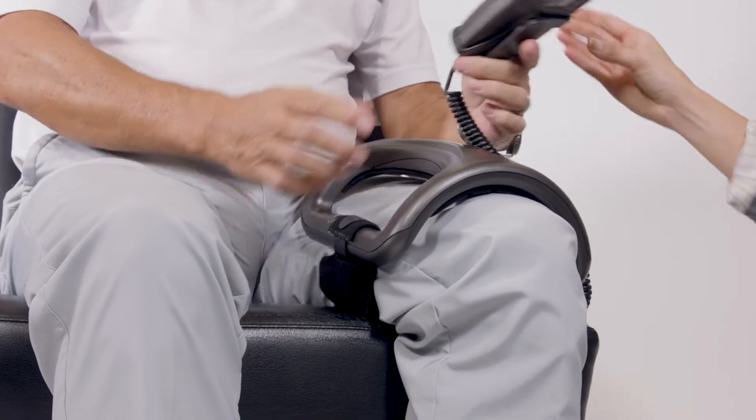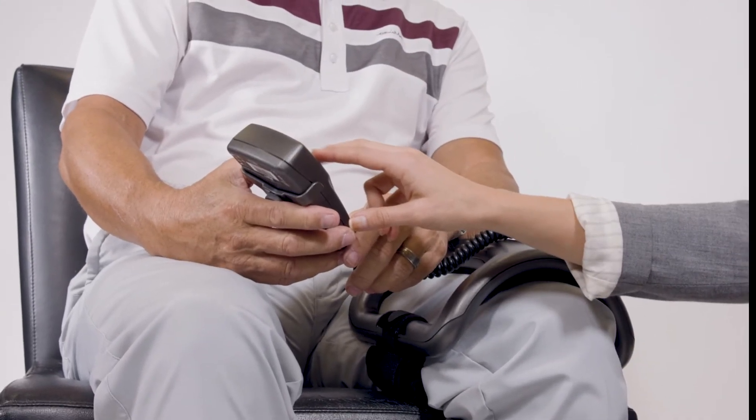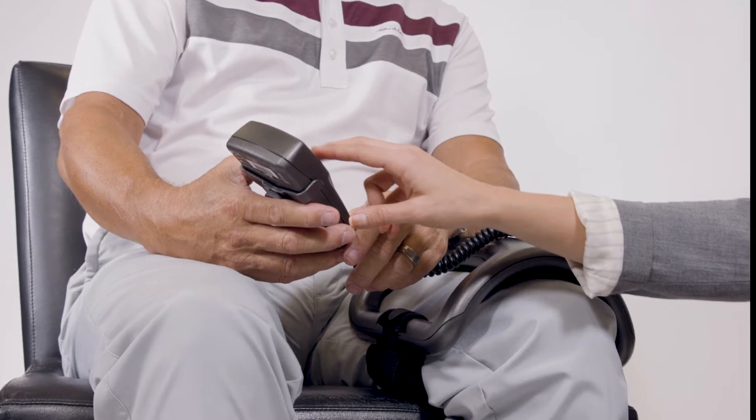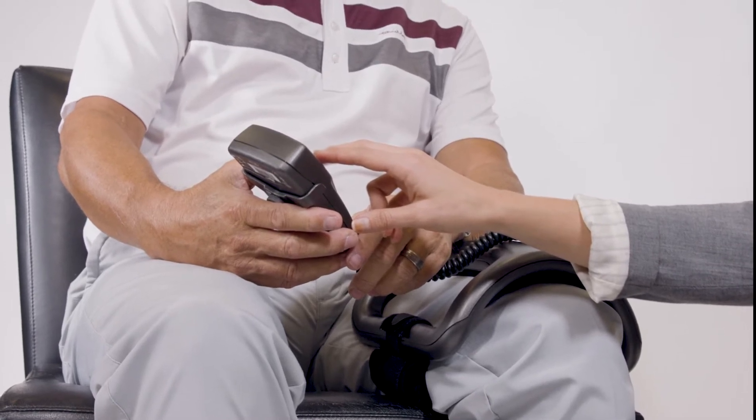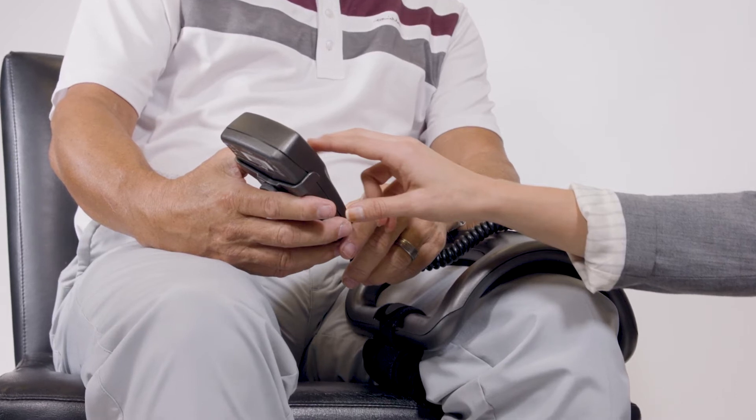Center the device on your broken bone. If using the strap, close it as shown here. It is recommended that you remain stationary for the duration of your treatment. If using the strap, however, you may move around as needed as long as the device remains in place over your injury.